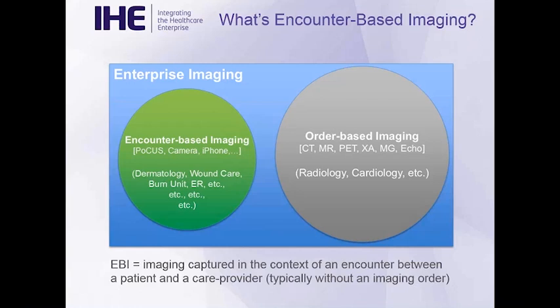And so you can think of this as being things that are captured with point-of-care ultrasound systems, with digital cameras, iPhones, tablets, and this is really, in a lot of ways, the long tail of imaging. This is stuff happening in the dermatology department, in wound care, burn units, ERs, et cetera, et cetera. You'll notice there are a lot more et ceteras in the left circle than in the right circle. It really is something that's being done throughout.